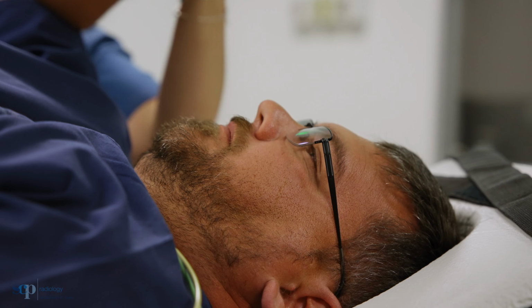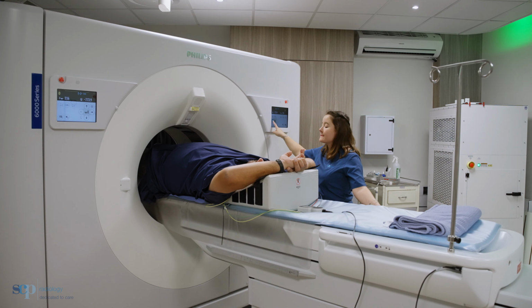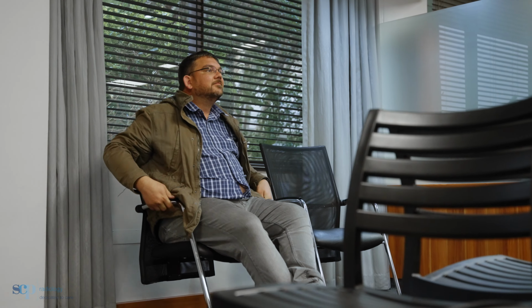So I think in the first place, it can be to confirm a diagnosis of coronary artery disease. Patients presenting with chest pain, it can be quite difficult for a clinician to determine what the cause is, and a number of things can contribute to that clinical presentation. If we confirm the diagnosis of coronary artery disease, then depending on the extent and the location of the plaques, it can either guide management, and that could be conservative management with just lifestyle changes, initiation of medication to help lower cholesterol or improve other cardiovascular risk factors, or if necessary, help referrers to guide their intervention and procedures to try and open up those blood vessels that are narrowed.